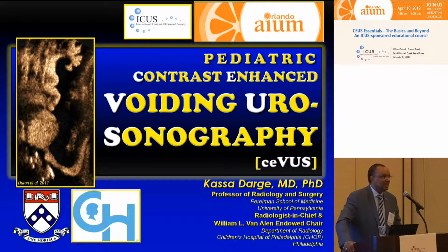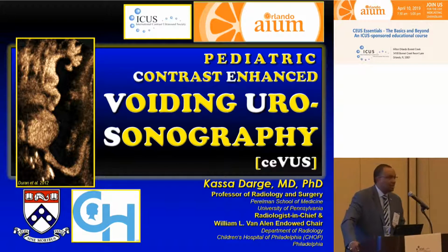And I have to admit, to see so many people at the end of the AIUM staying and wanting to learn about contrast ultrasound, it's really motivating for all of us who are doing it. I'll be talking about some pediatric applications, but I can assure you these same pediatric applications are applied in adults for various stuff. And you can also use some of these for additional techniques in adults. So even if you don't have pediatric patients, the methodology applies to all. So bear with me and just don't be discouraged just in case you're not doing children.